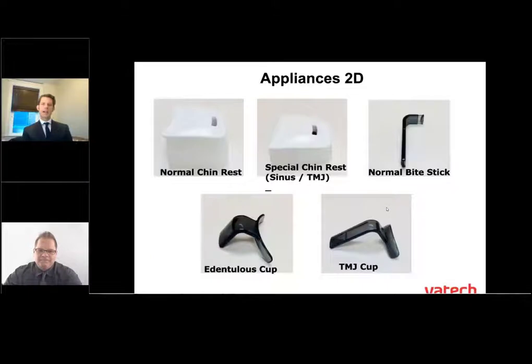So I think following our patient protocol for positioning the 3 beams, mid-sagittal, Frankfurt horizontal, and then finally our canine, and getting their head slightly tipped down is going to give us that nice smile on there. Right. Now may be a good time to kind of move into some of our appliances there, Paul.